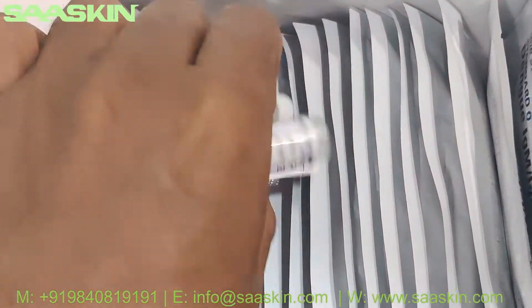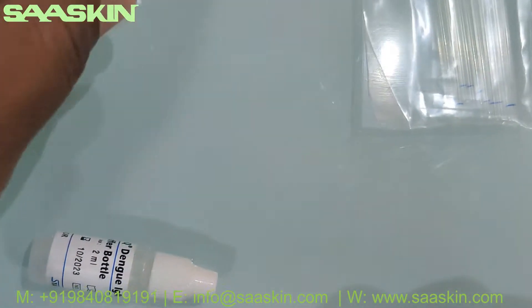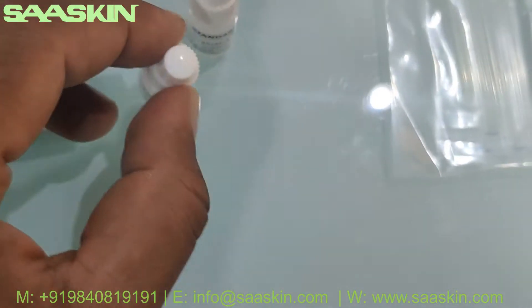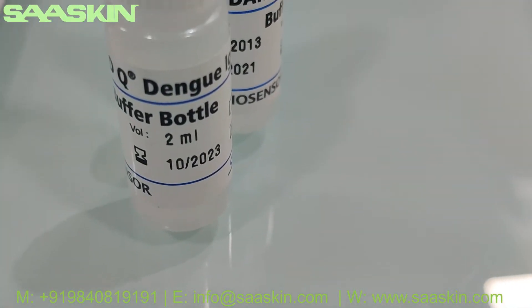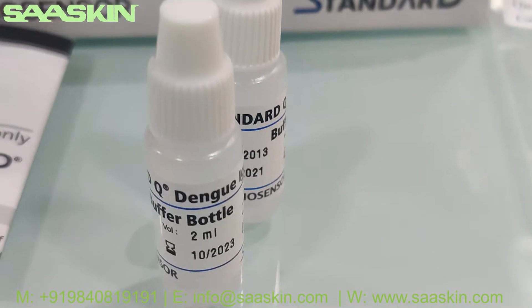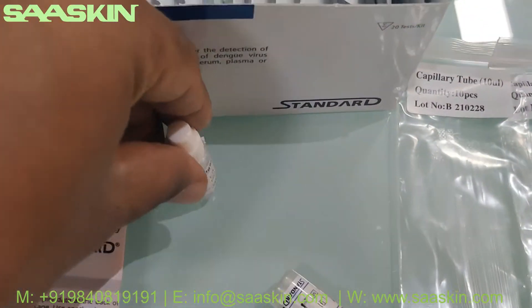You also have two buffer bottles. Each buffer bottle is 2 ml, and you get two bottles in the kit. These also have a two-year expiry period.